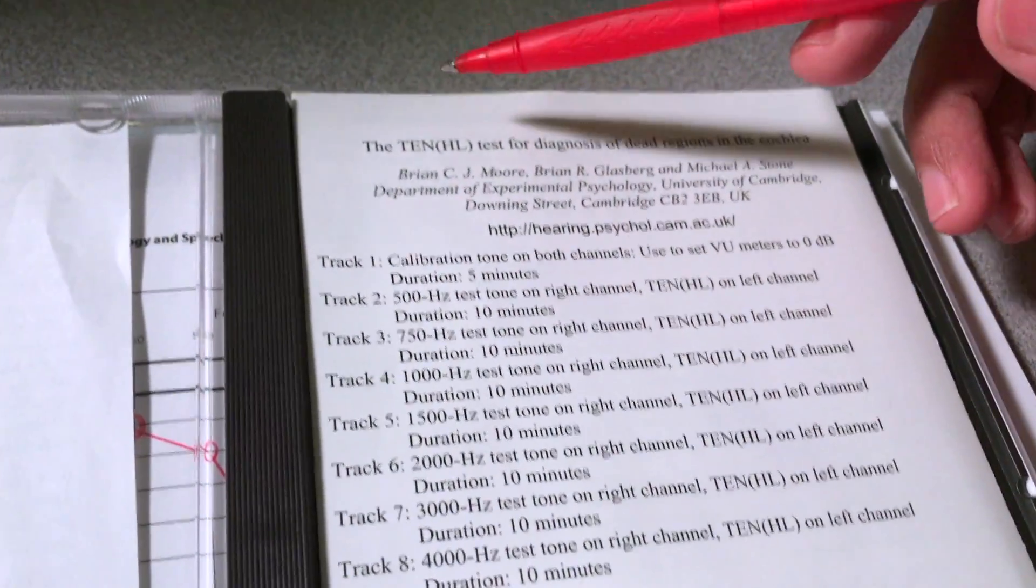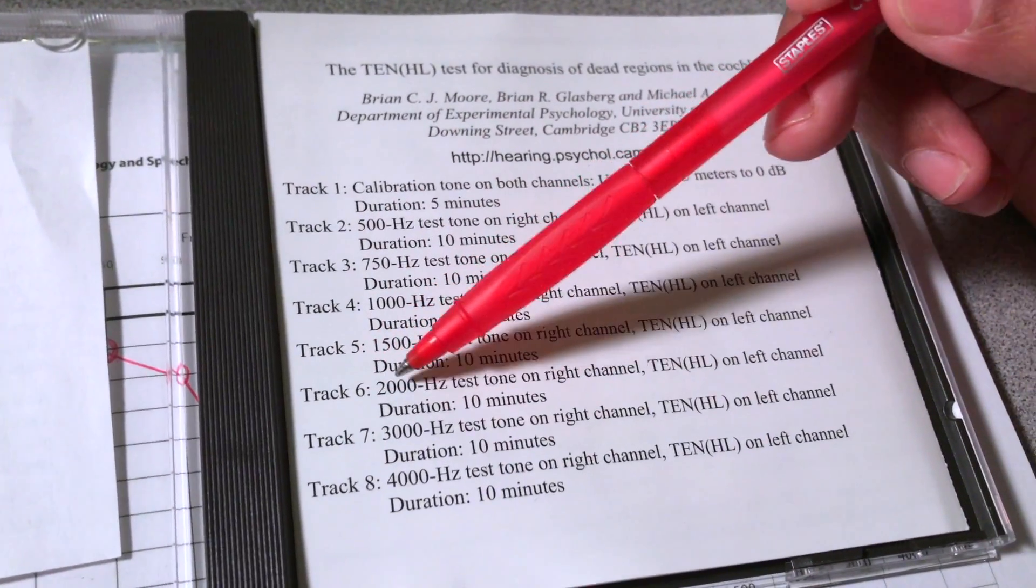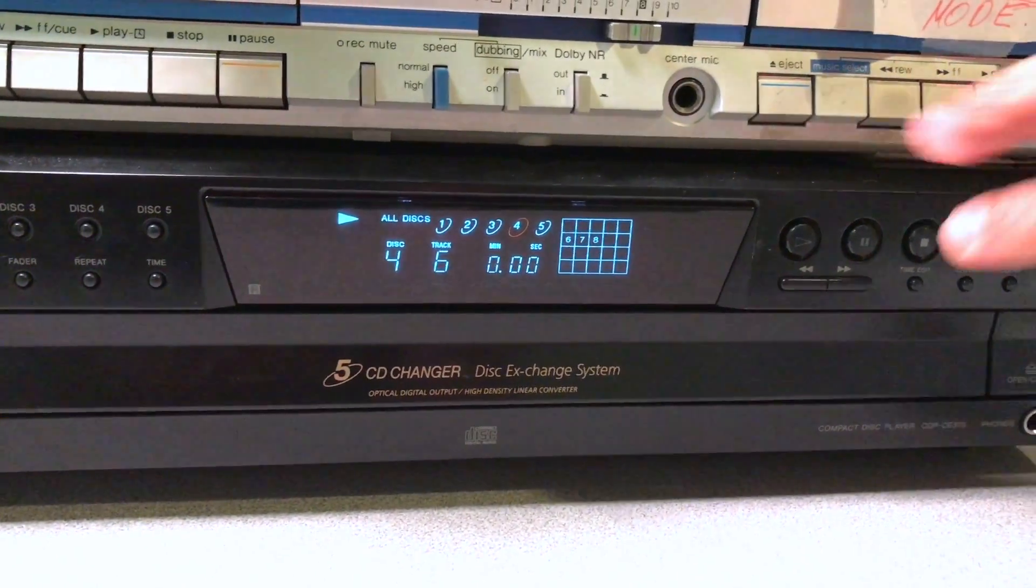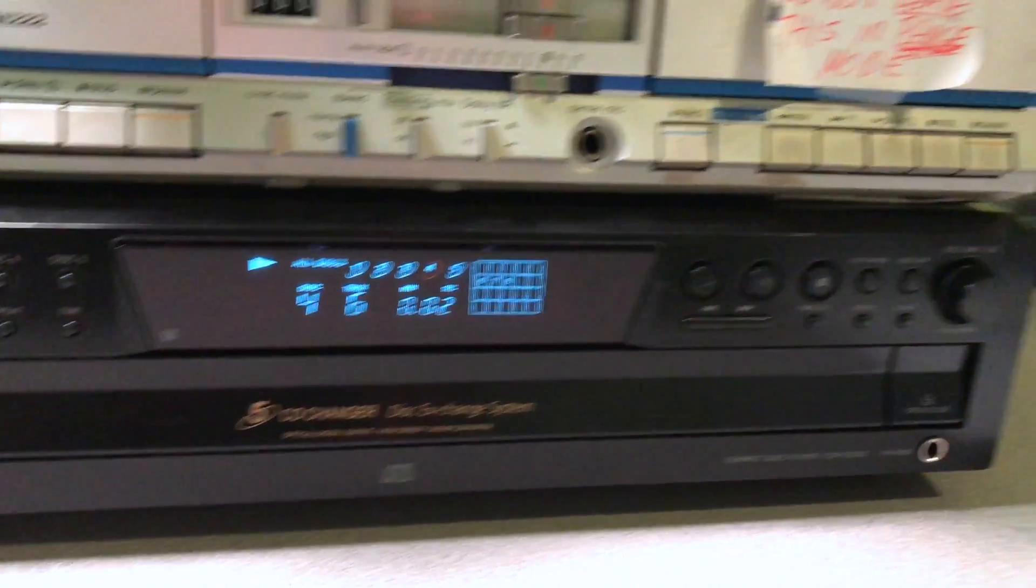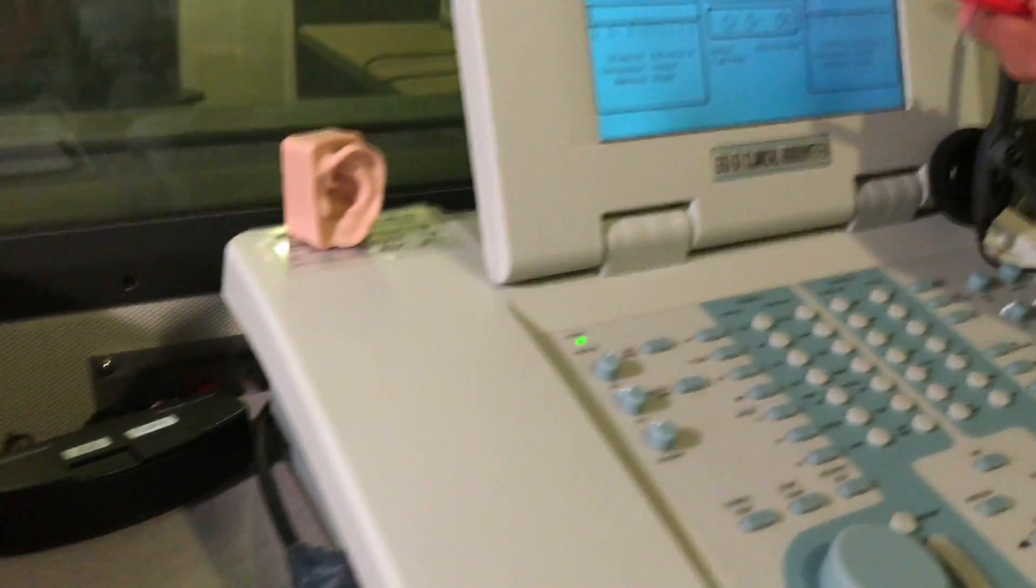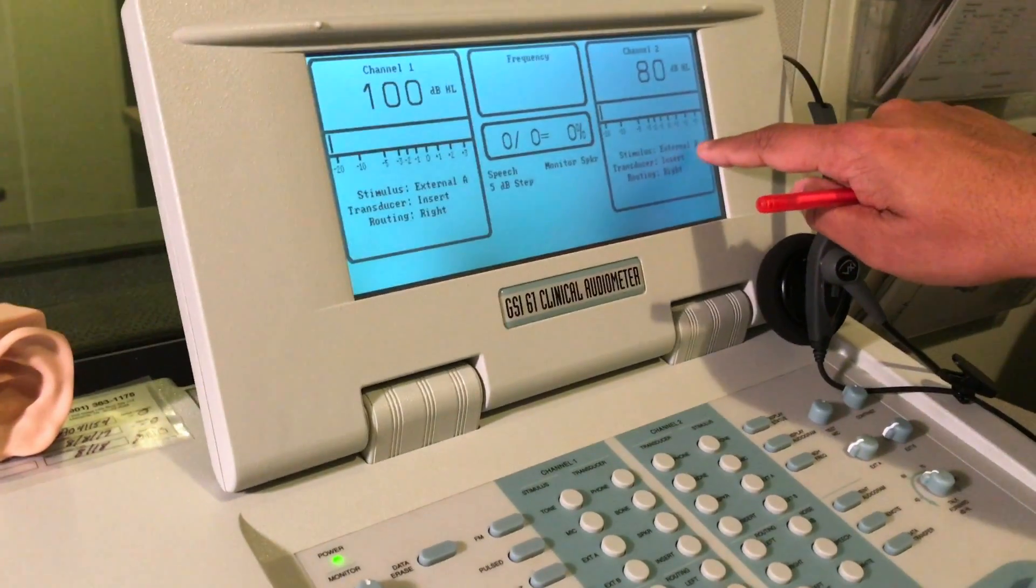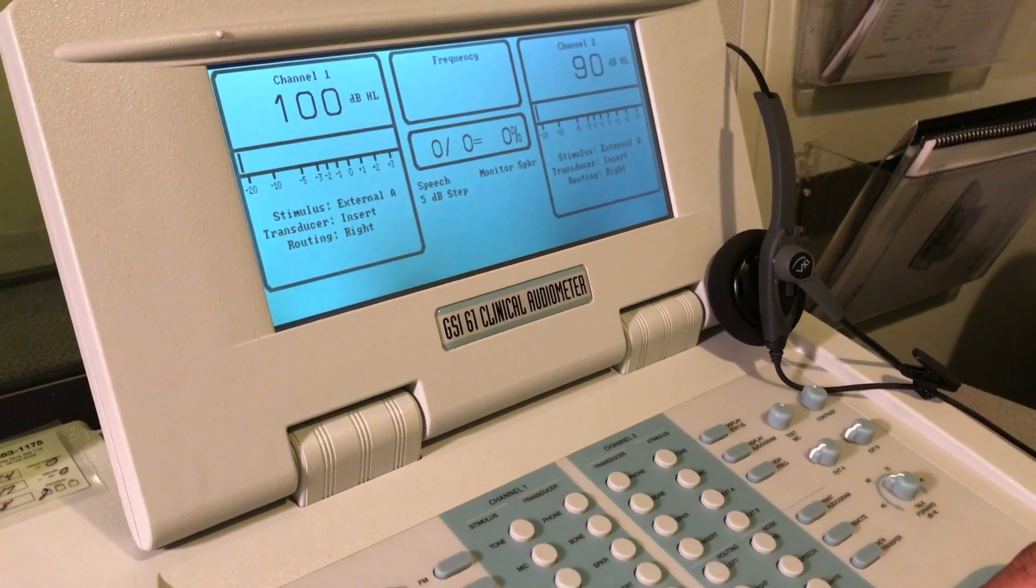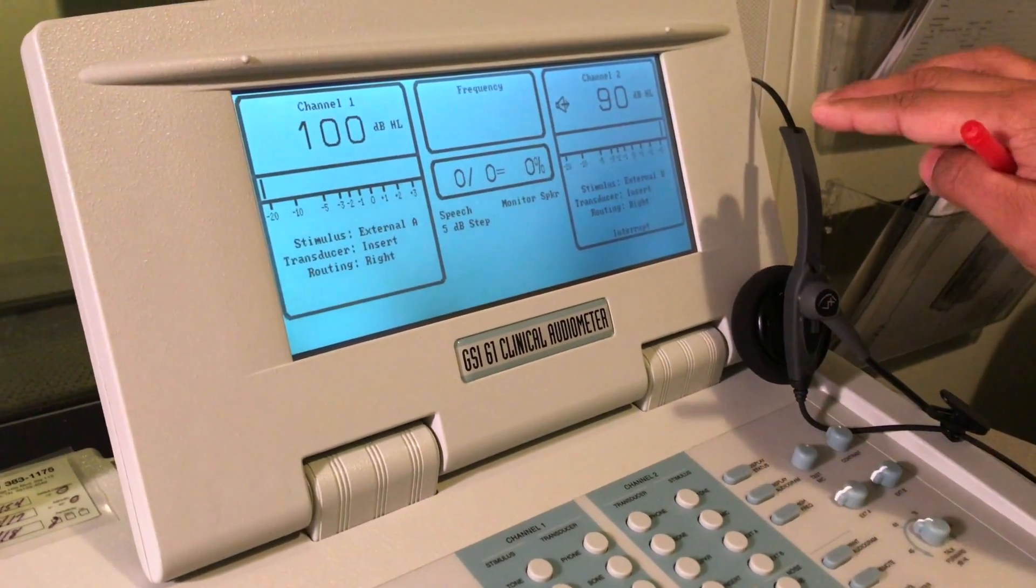On the TEN CD, track 6 is for 2000 Hertz. What you need to do is select track 6 and then play the signal through the CD player. Here on channel 2, you need to select external B and set the intensity of the noise at 90 dB.